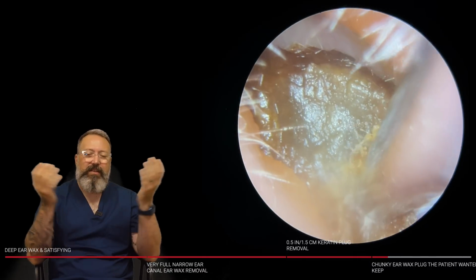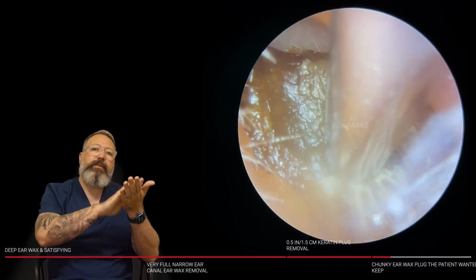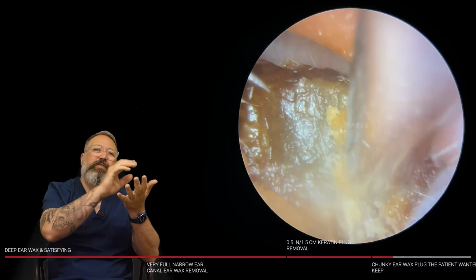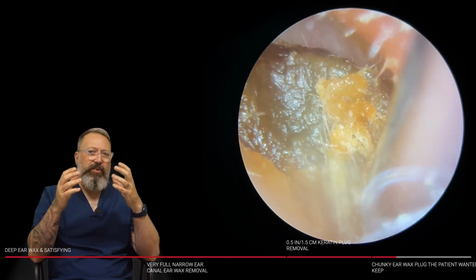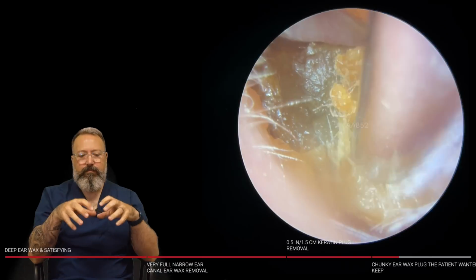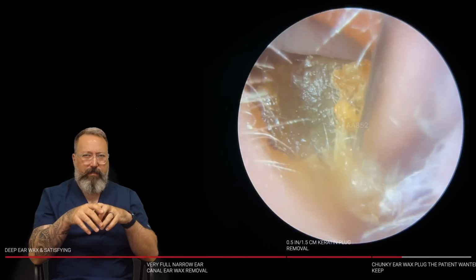which makes it just sound that, that's just complete opposites of what they are. But you can see there's almost that little bit of a sheen there, but it's not really shiny. It's almost got this sort of slightly matte appearance to it, if that makes sense. And that's how we know the wax is really, really hard. Because it's hard, it's dried, stuck firmly down onto the canal. So it's not really budging anywhere.